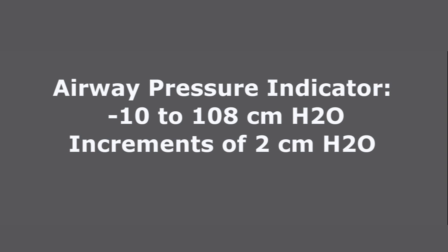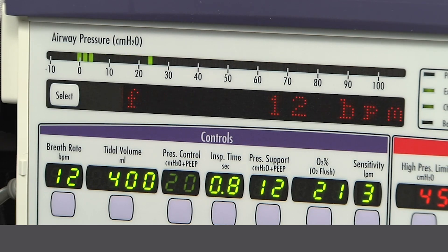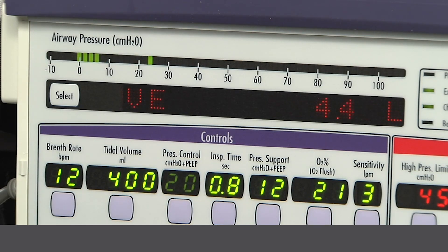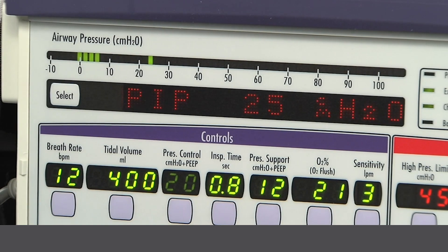The monitored data is displayed for 3 seconds in the following order: the peak inspiratory pressure, the mean airway pressure, the PEEP, the frequency or total breath rate, the exhale tidal volume, the minute ventilation, the IE ratio, the calculated peak flow rate for volume breaths, and then back to the peak inspiratory pressure.